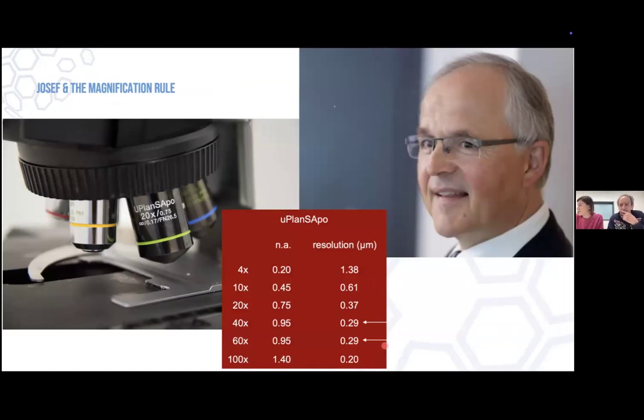We have two questions. Excellent. First one, do you think that looking at the intimate mechanism of HER2 amplification could separate the responders from non-responders to traditional anti-HER2 therapy? Yes, I think so. But do we have a means to do it? This is something that always puzzled me. Why is it that we keep measuring expression of HER2 and we don't measure expression of molecules that tell us the pathways are activated? Exactly. And that's the way it is. We are just pathologists. We're just reading samples.